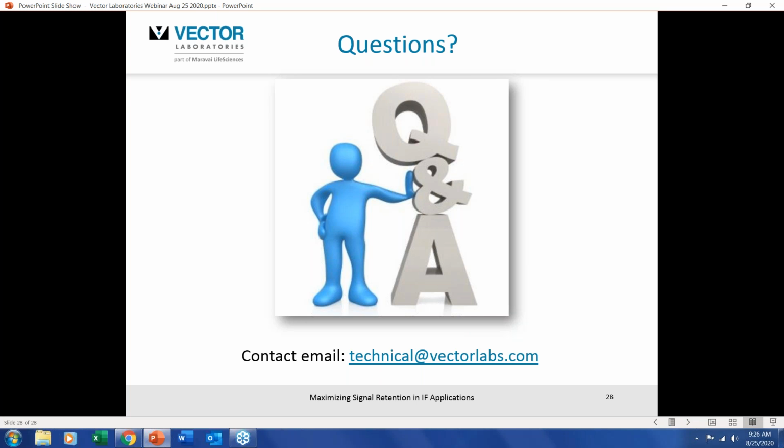The next question is, can you overfix the samples or tissue? What is the result? So when I did mention earlier in the tissue preparation about fixation conditions, I did touch on choice of fixative and the amount of time it would be in fixative. In most research-based applications, the concern for me would be underfixation, whereby investigators leave, say, a chunk of tissue, let's just say 3 millimeters by 3 millimeters, or a centimeter by 1 centimeter, in there only for a couple of hours or a brief period of time, whereby the center of that tissue does not get fixed.